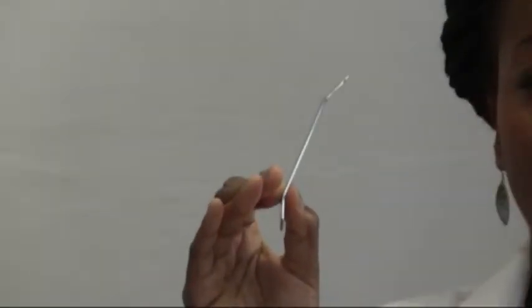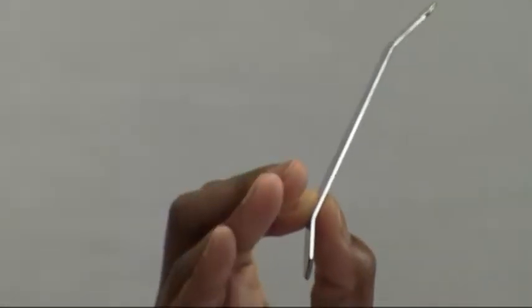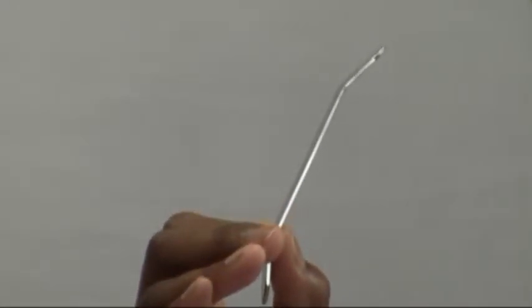The plate expressor can be positioned behind the anesthetized eyelid, and when positioned parallel to the meibomian gland, gentle digital pressure on the outer lid prompts meibomian expression.